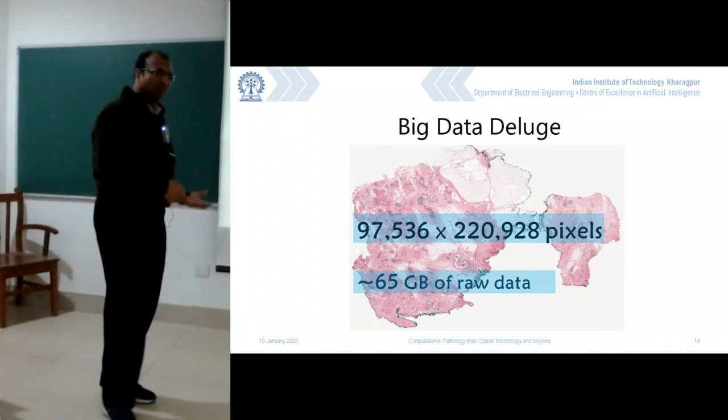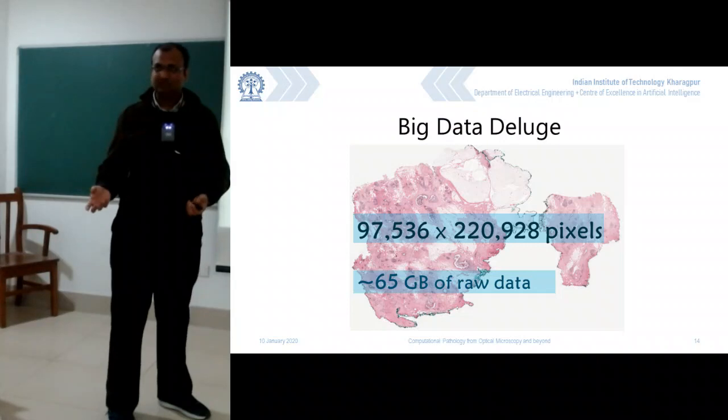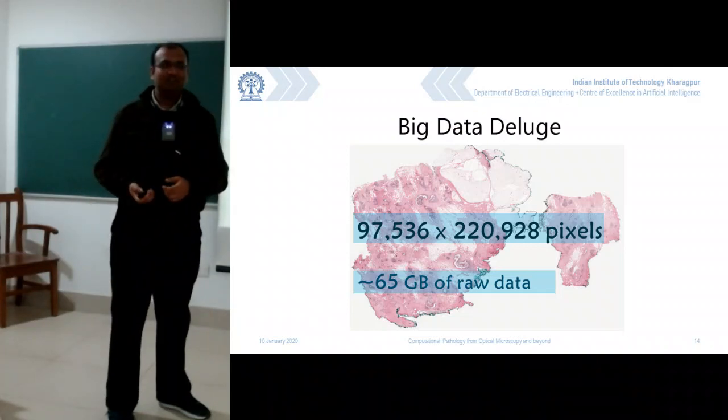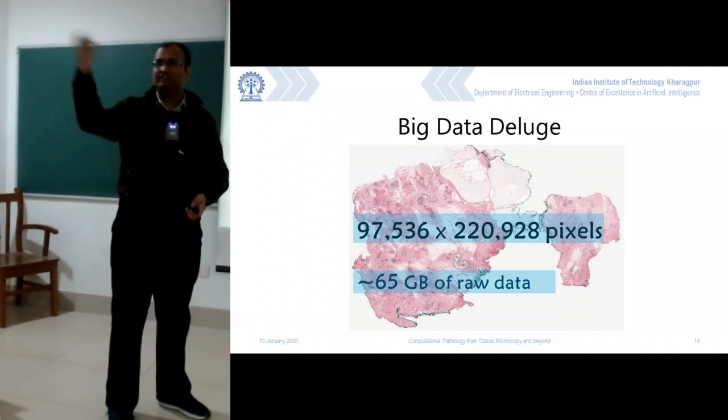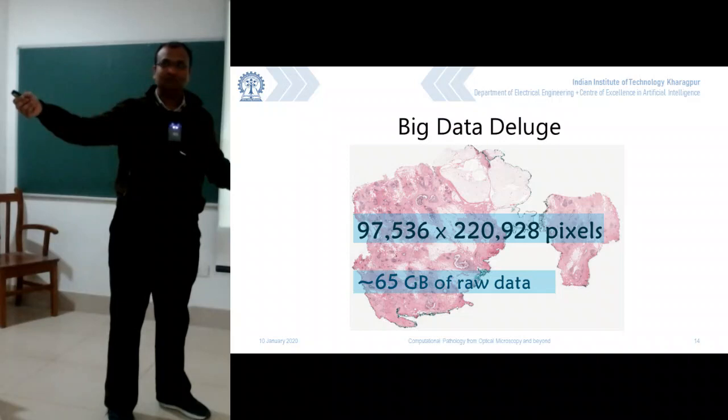So this whole story is about how we acquired images at a very low resolution such that this whole pixel space is much smaller, and then what we did is something called super resolution. Essentially, one pixel I will map onto 4 pixels, a 2 cross 2. But if you want to map a one-to-many function, all of you know that it's an intractable way of mapping something.